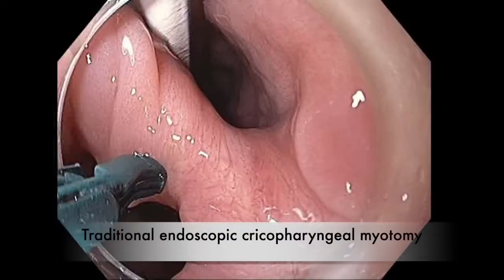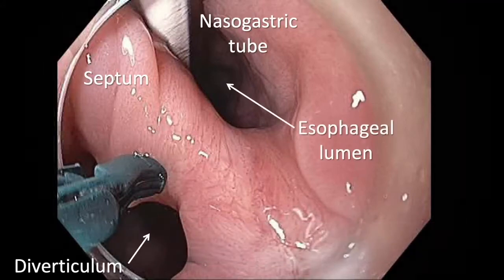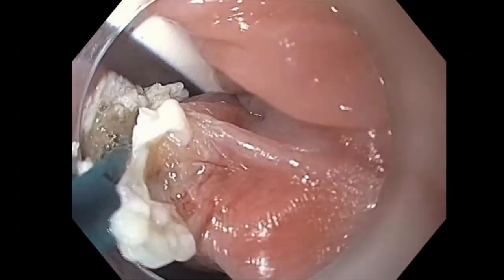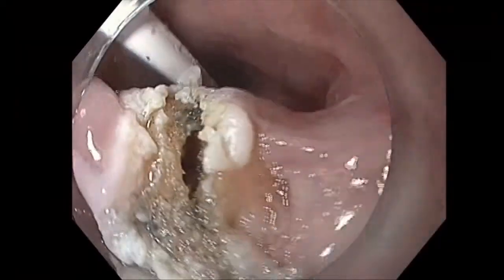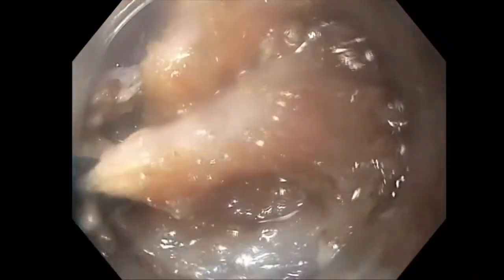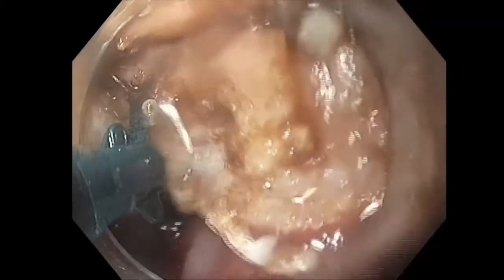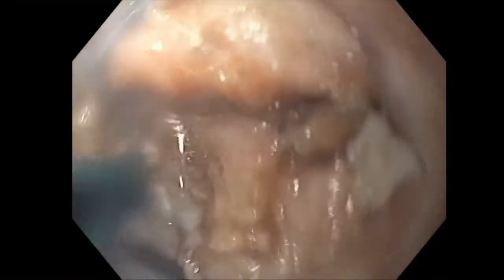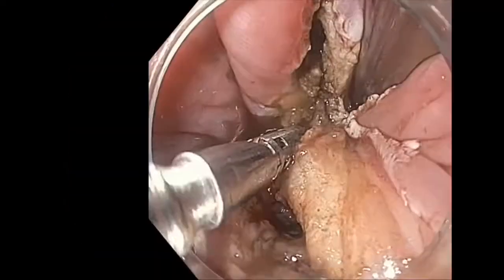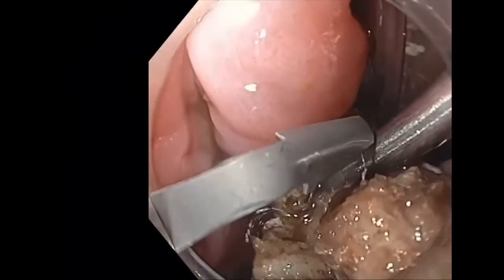We will first discuss traditional flexible endoscopic cricopharyngeal myotomy. During this procedure, a nasogastric tube can be inserted to delineate the true esophageal lumen. Here, a concurrent septotomy and myotomy of the cricopharyngeal muscle is performed. The aim is for a complete myotomy, however, this can be difficult to gauge endoscopically, and an incomplete myotomy is felt to be a large contributor to high reported relapse rates. Once the septum is transected, through-the-scope clips can then be placed at the apex of the incision to prevent perforation.